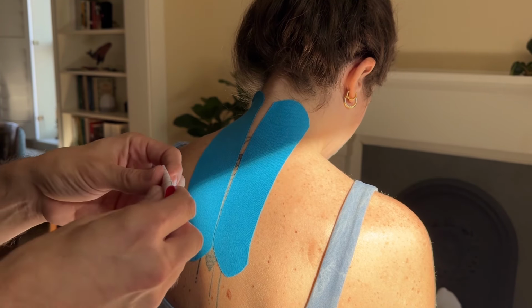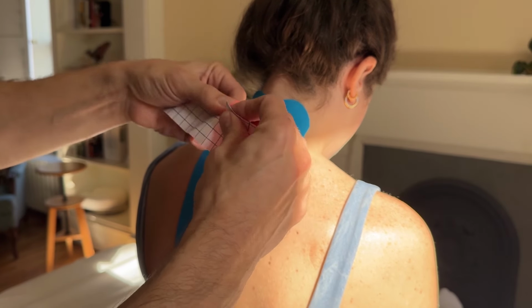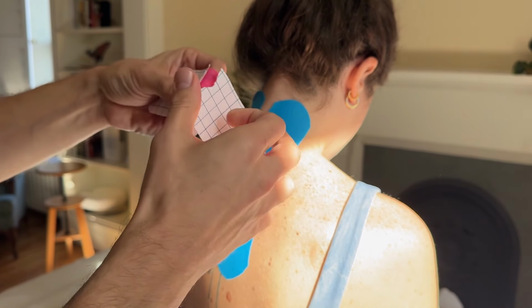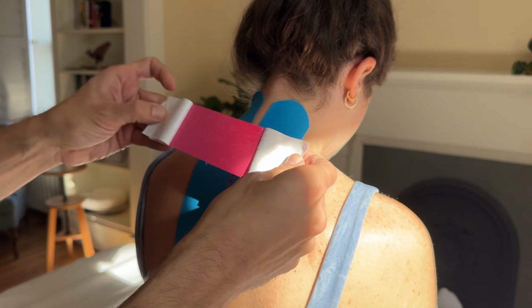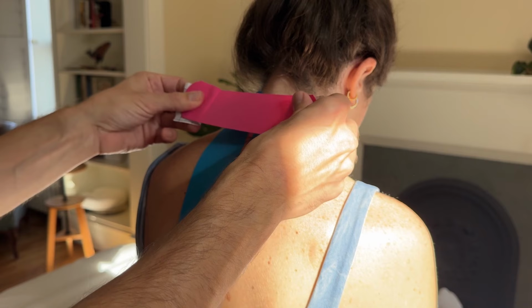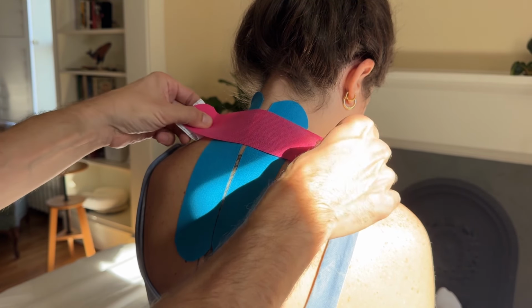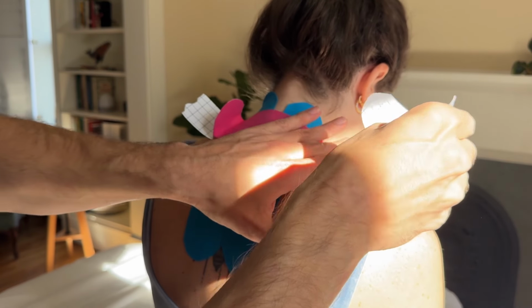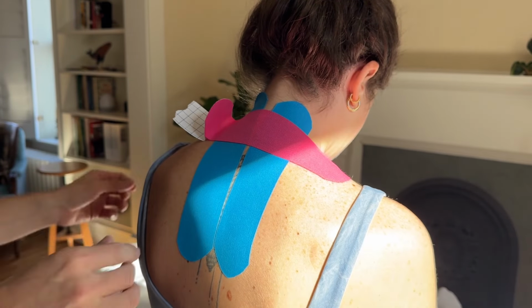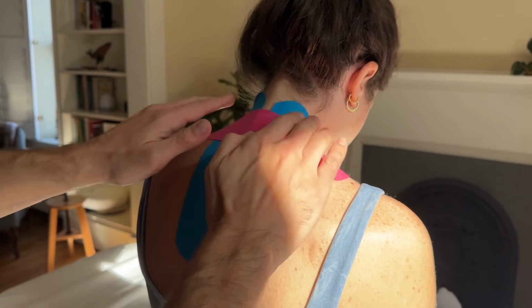Now with the last strip, you want to cut it just a little bit smaller. And when you're laying the tape down, you want to break the paper in the middle this time. You're going to pull the paper on both sides. And then you're going to create an 80% stretch with the tape. Lay the tape down over the point of tension in the neck. And no stretch should be over the anchor points because that's where the tape is going to be stabilizing.